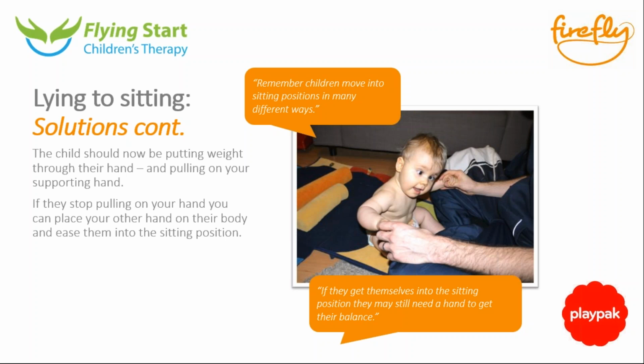There are other ways to teach children from laying to sitting. This is not the only way. Kids learn to move in various different weird and wonderful ways. The important thing is that this is a typical movement pattern as opposed to an abnormal or a destructive movement pattern, and that's what we want to avoid. So I'm not saying that this is the way that you must or should teach your child to lay to sit, and it should definitely be something that is guided by your therapist, but it is just highlighting that we really do aim for normal or typical movement patterns as opposed to destructive ones.